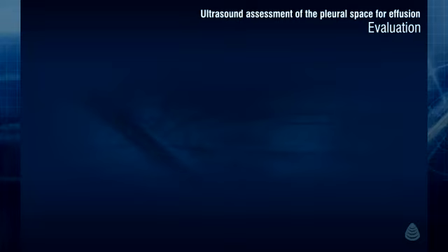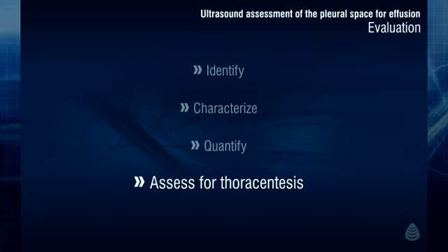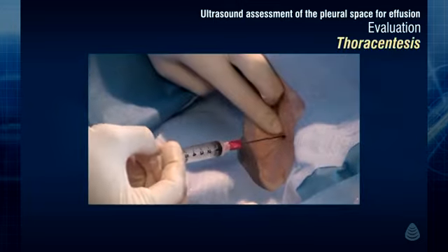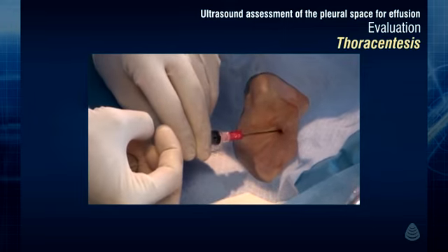Once pleural fluid has been identified, characterized, and quantified, the bedside sonographer is left with the question of whether thoracentesis should be performed. Thoracentesis is a safe procedure in the ICU, even in mechanically ventilated patients.